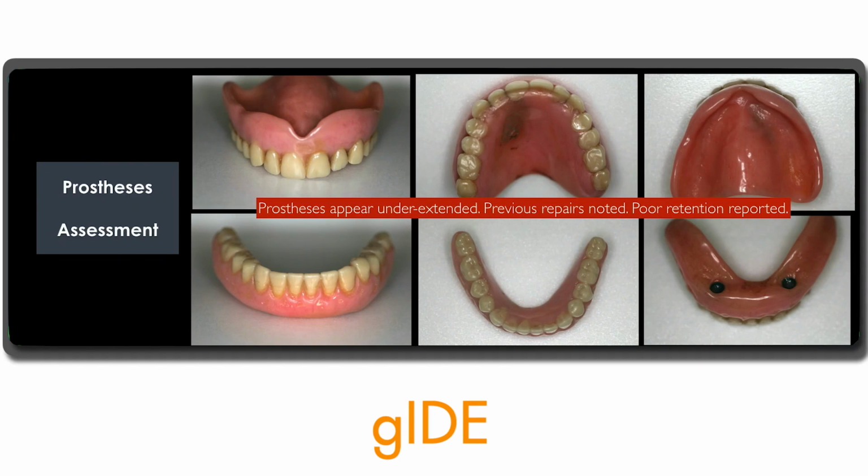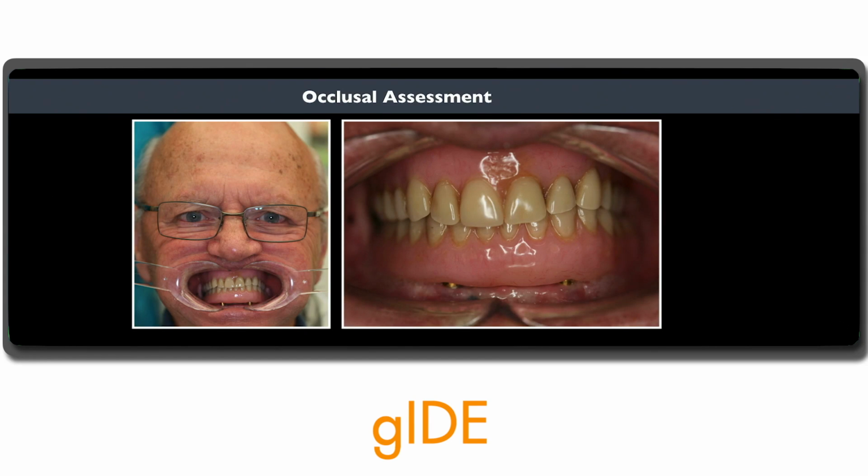When you look at his prosthesis, these prostheses appear underextended. You can see previous repairs had been carried out. You can see some meshwork in the maxillary denture, but you'll notice that there was poor retention reported by the patient. You can probably see in this image here, as he bites down, his denture lifts off those attachments.